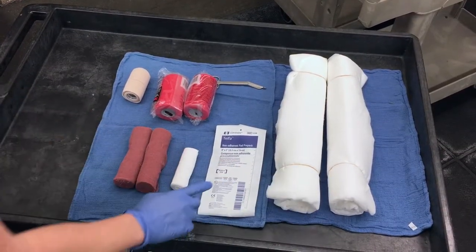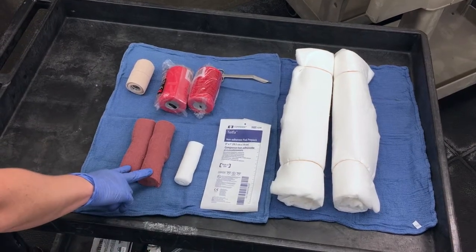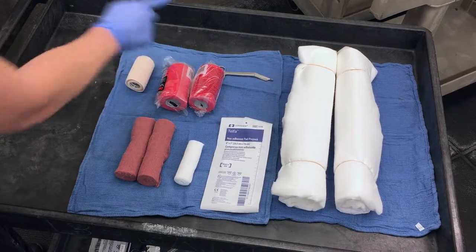You need two combi rolls, a telfa, a white cling, two brown gauzes, two rolls of vet wrap, one roll of elasticon, and bandage scissors.